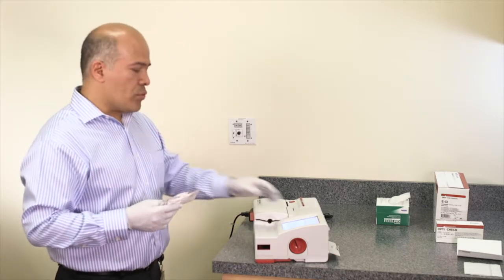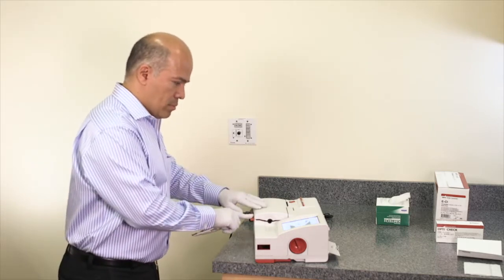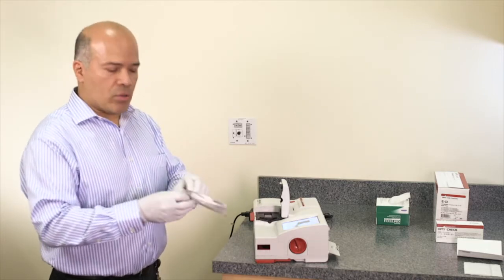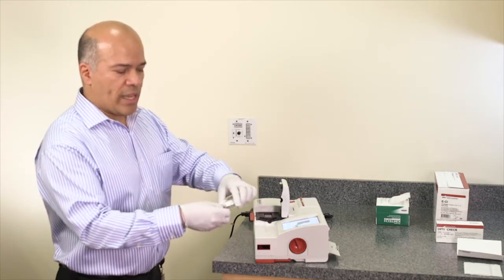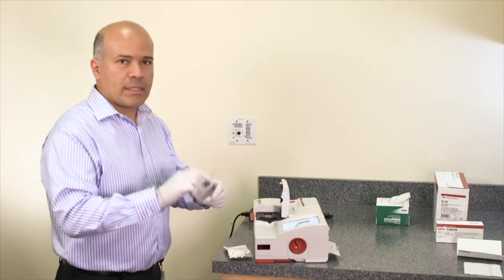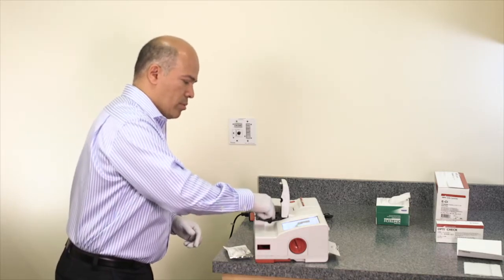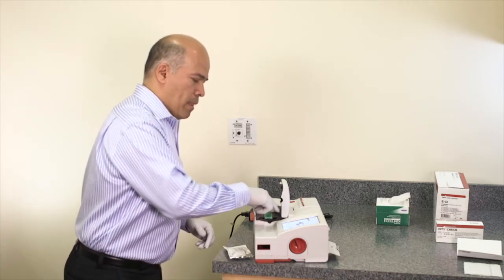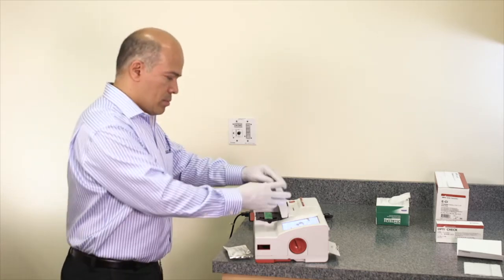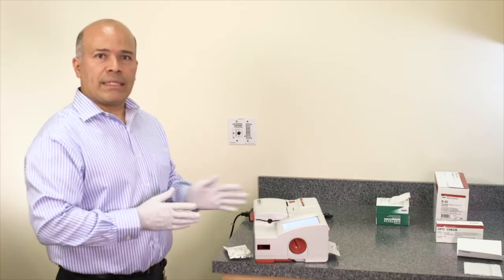The analyzer gives a warning to open the cover and insert the cassettes. Open the end of the pouch, remove the cassette, hold the cassette on the finger grips, and insert the cassette on the chamber. Once the cassette is inserted, the analyzer prompts to close the cover. Close the cover and the tests begin.